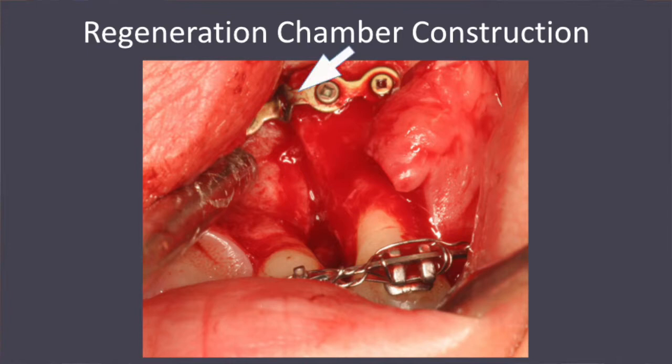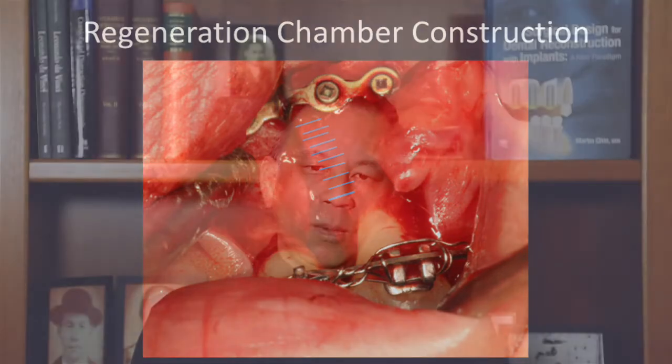You can see that the bone plate has been bent with a step which deflects the fragment laterally. The purpose of this is to position the Sharpey's fiber system that is embedded in the bone at the osteotomy site labially to allow direction of the fibers to have access to the labial surface of the lateral incisor.